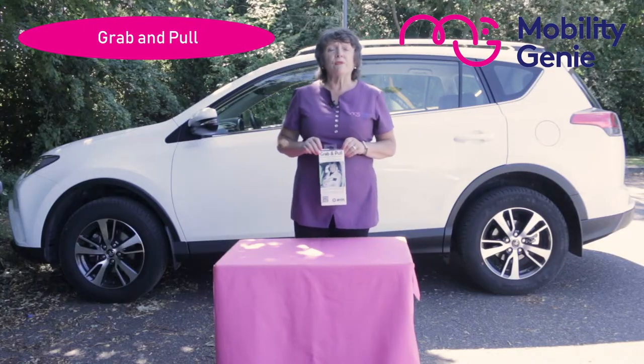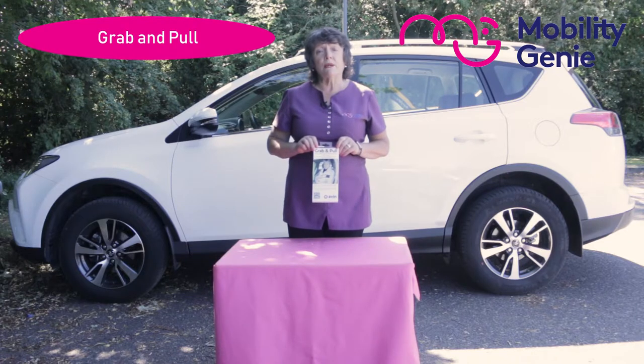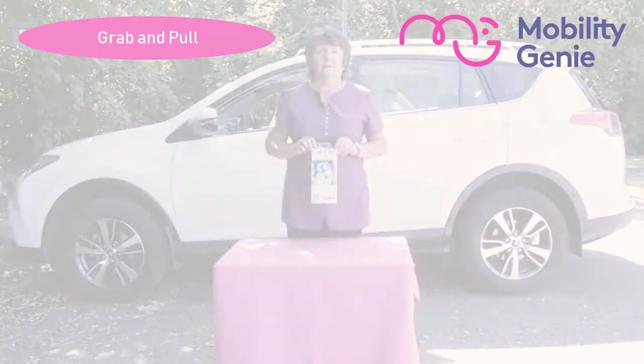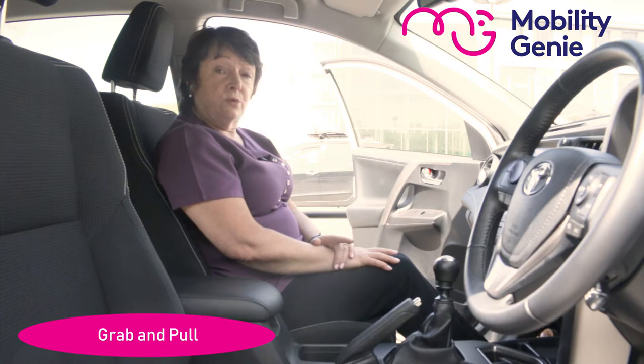Now I'm going to demonstrate the grab and pull in the car. The grab and pull is used in a situation where a person's reach is impaired because of a mobility problem, possibly with the shoulder or possibly with arthritis in general.